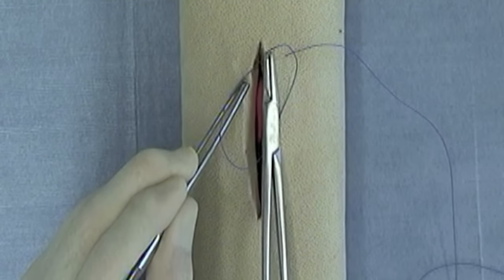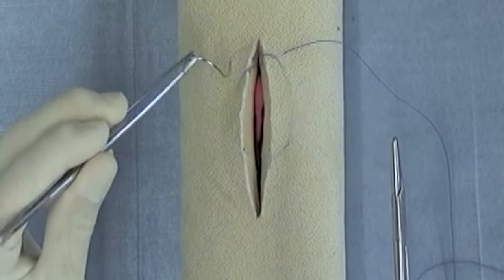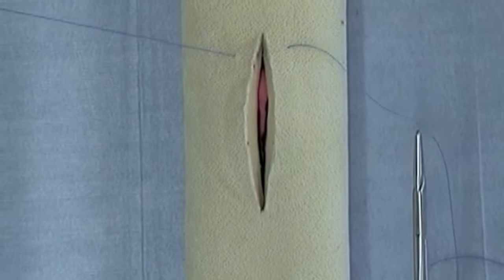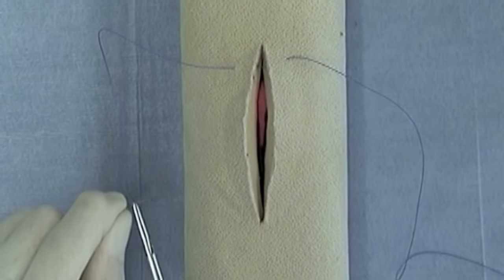Again, this is a far bite, or a bite that's farther away than the near bite on the far side of the incision.